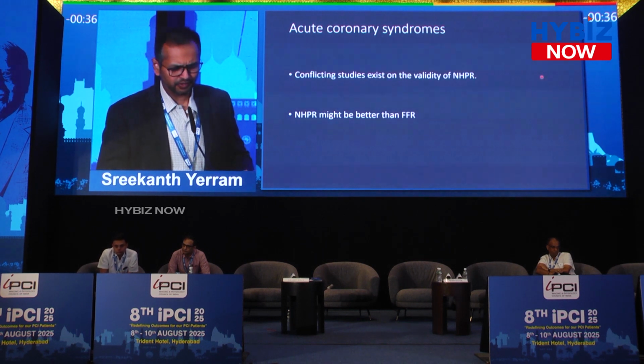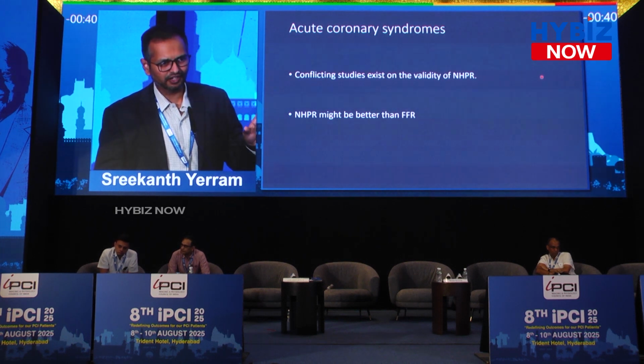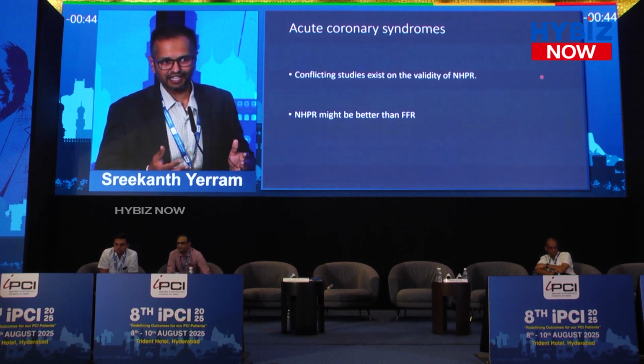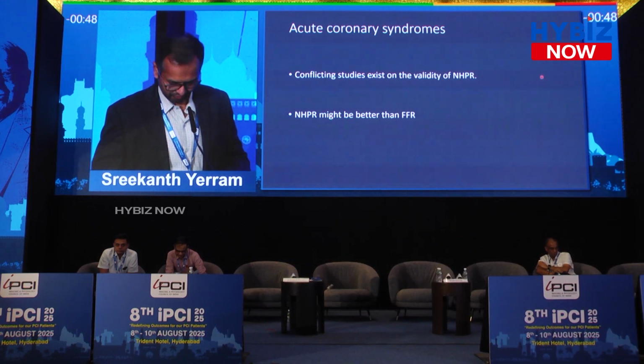Acute coronary syndromes, again, we don't have data, but we all know that immediately after acute coronary syndrome, there is some disturbance in the microcirculatory resistance. So again, IFR, RFR should theoretically be better when compared to FFR.